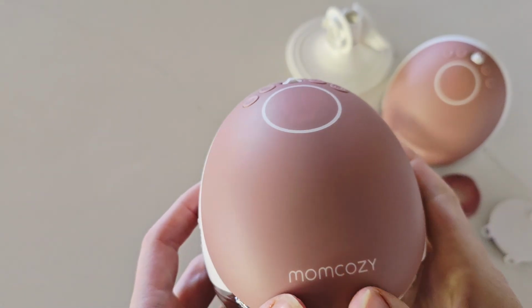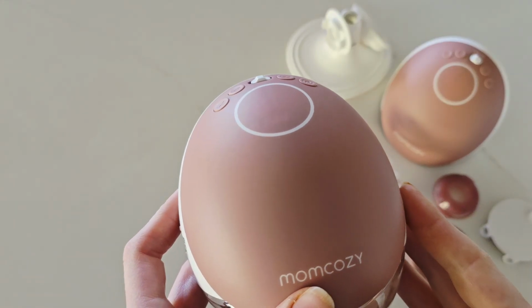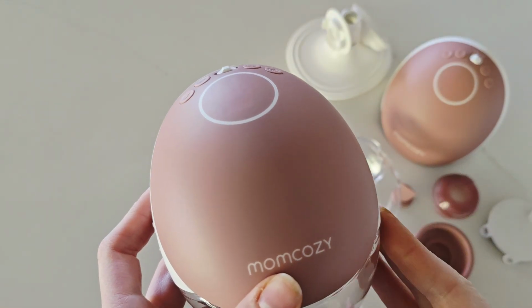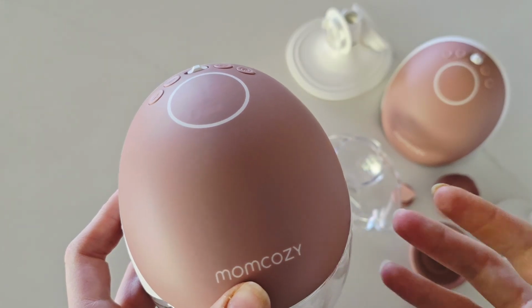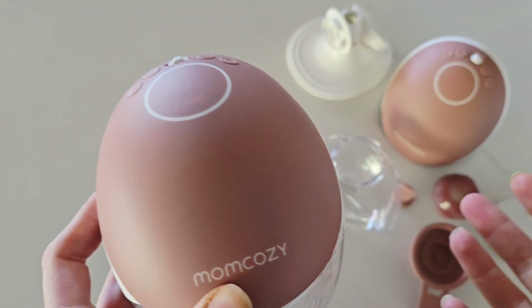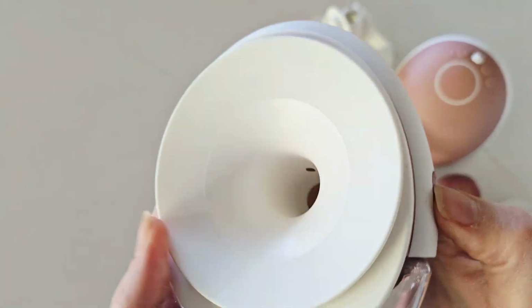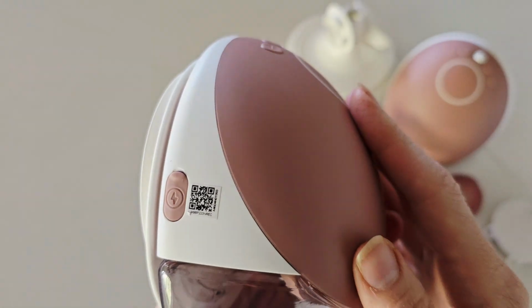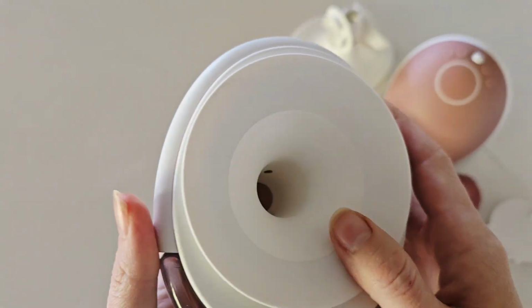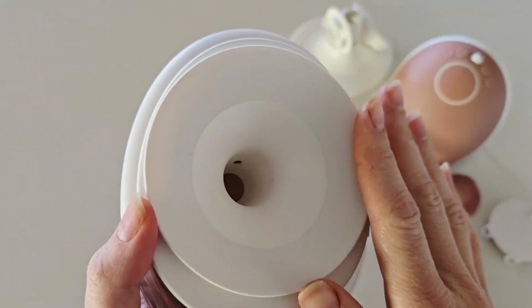And one of the biggest things is your loss of suction. If you're noticing that your breast pump does not have the same suction that it used to when it was brand new out the box, it might be a sign that your pump parts need replacing. With any pump, you have your pump motor that drives and creates your suction, but the suction is also created by having the flange sealed against your breast.